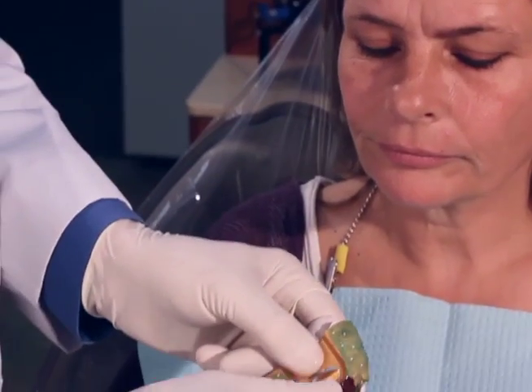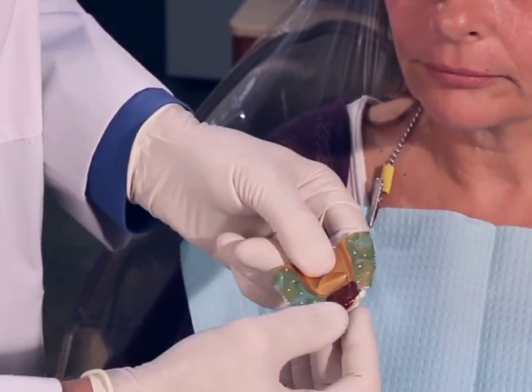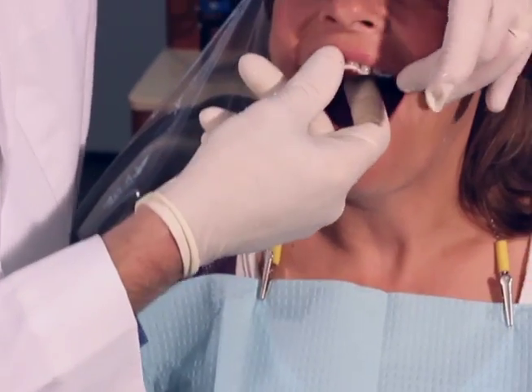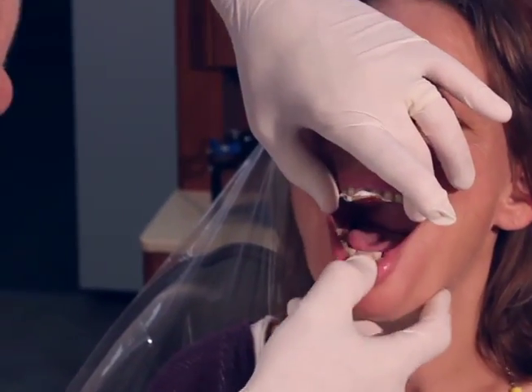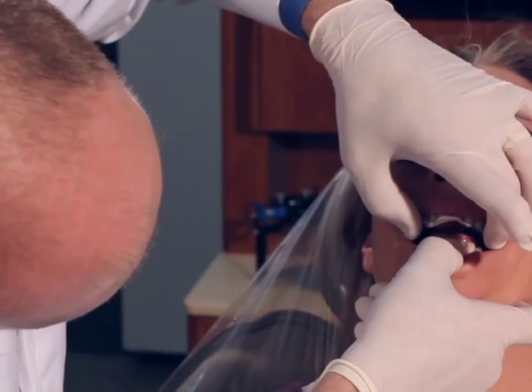After tempering in hot tap water, I can actually even mold this a little more anteriorly on the tray if needed. I'm going to place this in, roll the lower lip back again, back with the jaw, and have them slowly close — slowly, slowly, slowly.